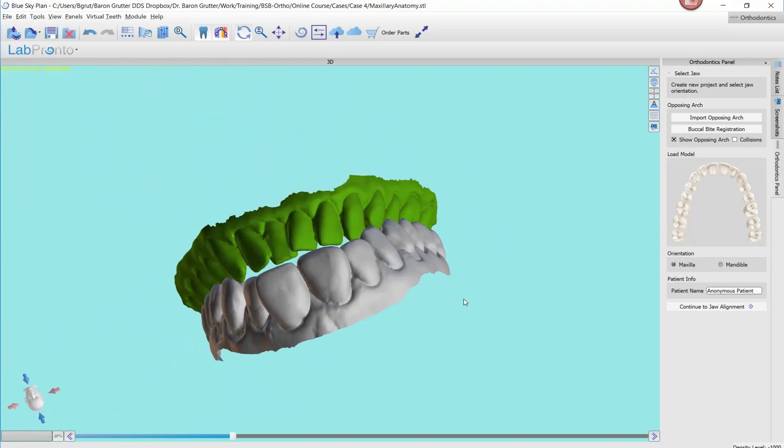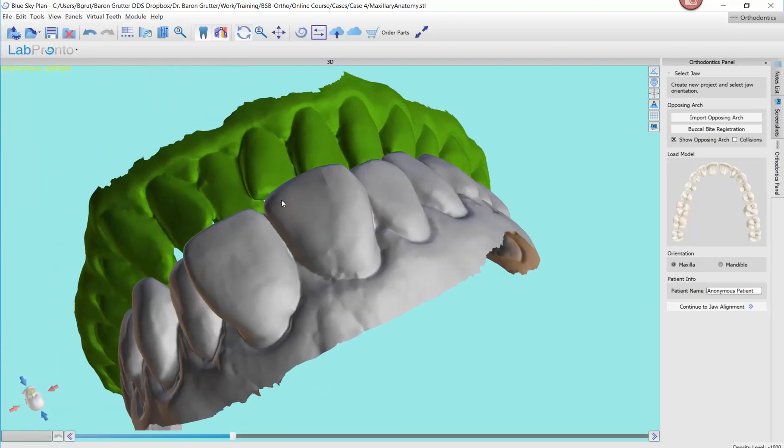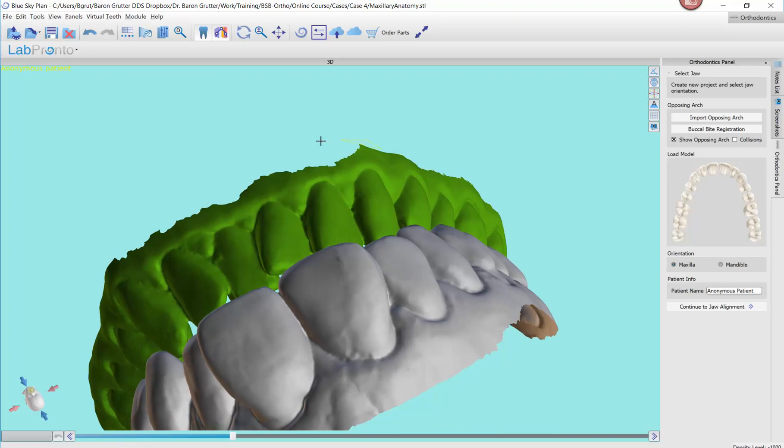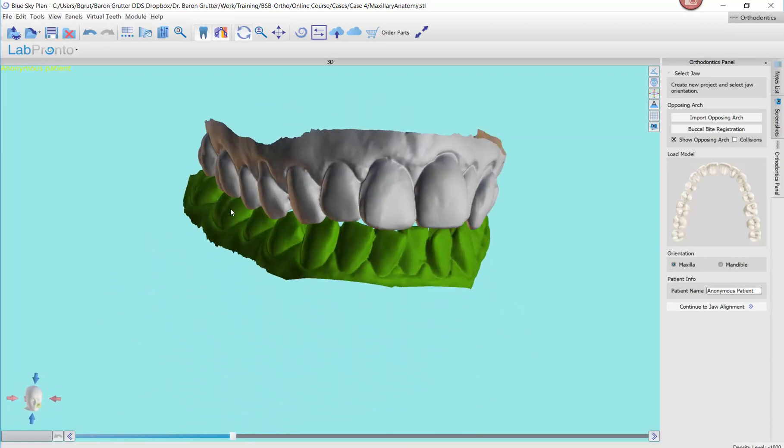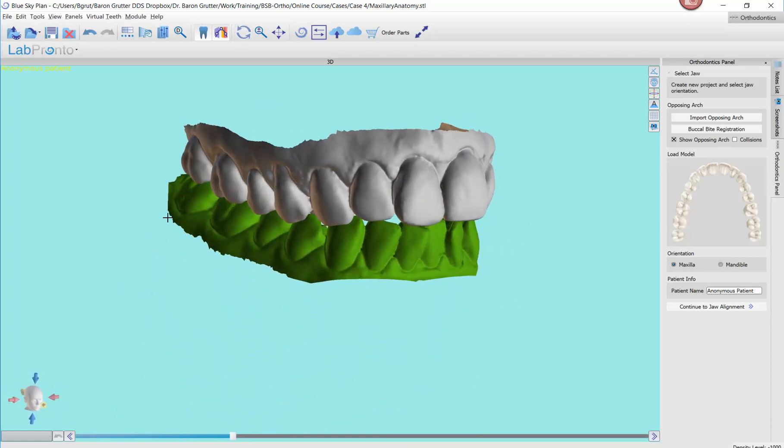And if you wanted to trim this even more, we certainly could. And there we go — these are trimmed up. Now I don't need to bother exporting them; I can bring them right into the ortho module. I am ready to go.